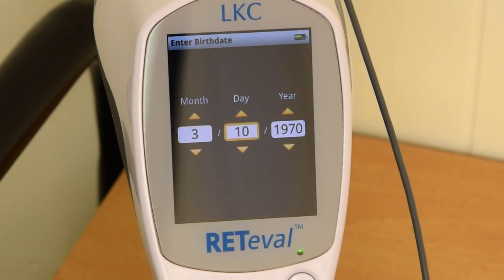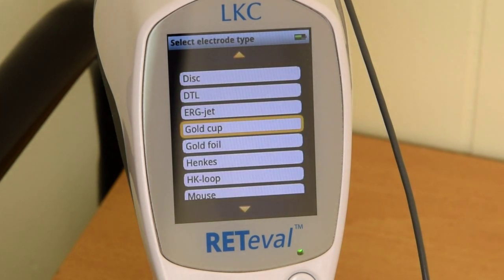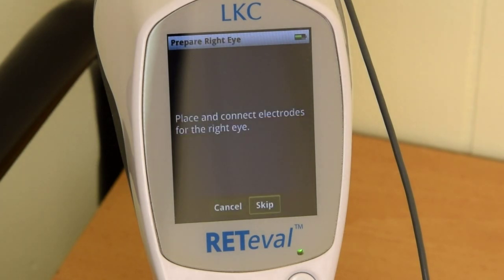Click next to continue. The device will then ask you to confirm the electrode being used. It will default to the gold cup electrode for flash VEP tests. Select the electrode and continue and you will move forward to the patient preparation portion.